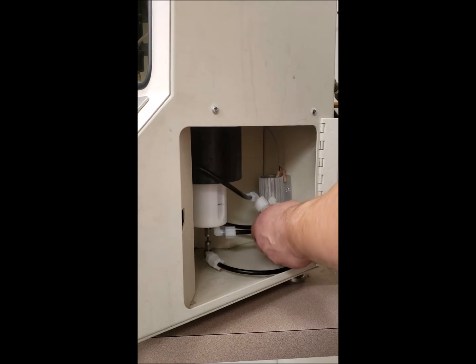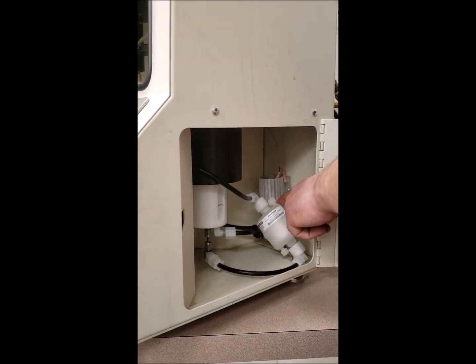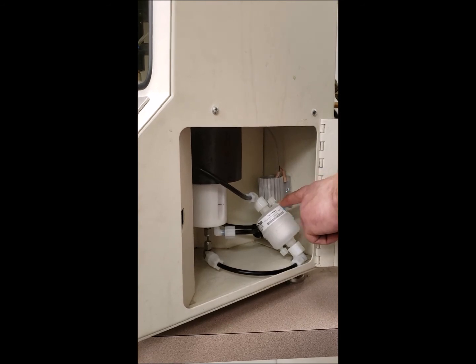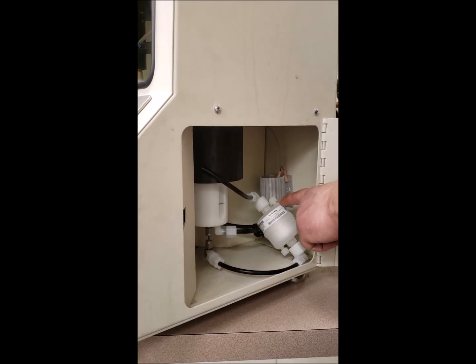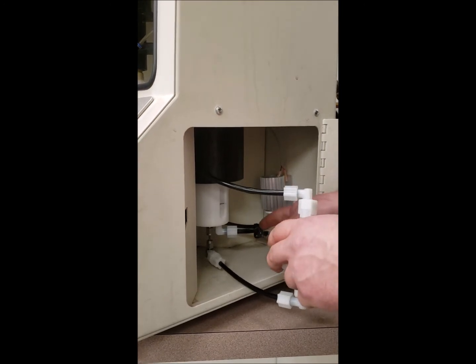The filter should sit inside the machine so that the bleeder valve is at the highest point in the machine. If you look at the tubing, there should be no hard kinks.